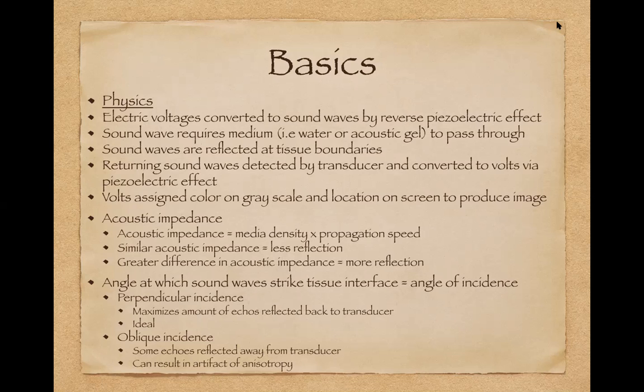And just a couple of key concepts in ultrasound. We talk about acoustic impedance. It's just saying whether that ultrasound wave can pass through the actual tissue boundaries. If you have something that has high impedance, you'll get a lot of reflection, and you pick up more signal on your screen, whereas something that has less impedance will let the waves go straight through.